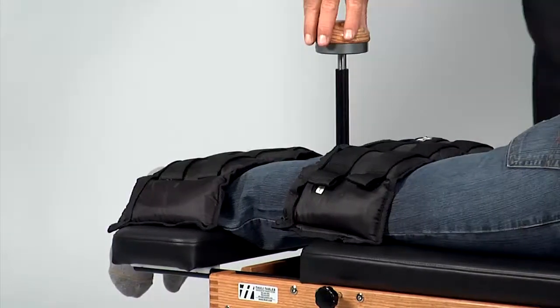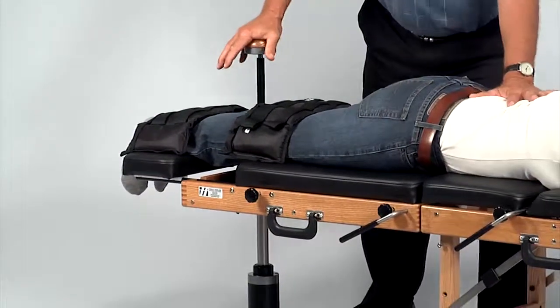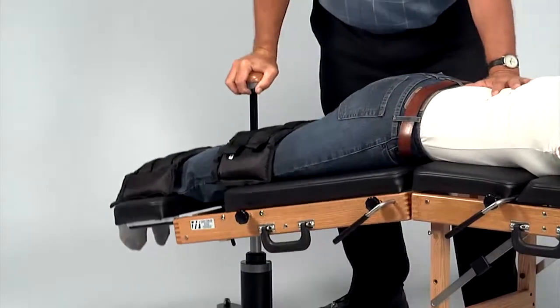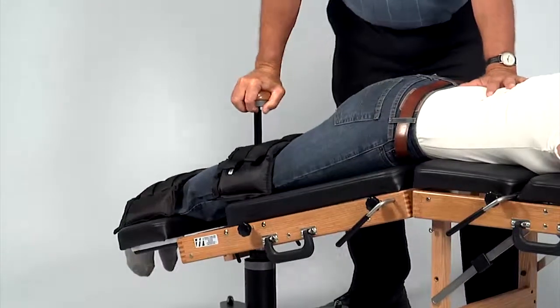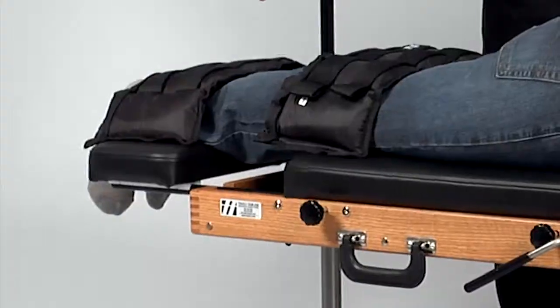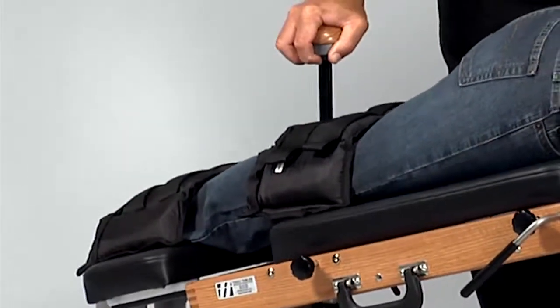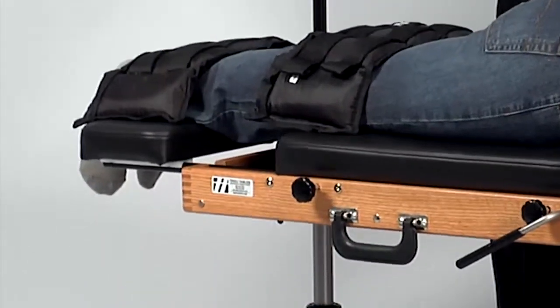Dr. Thule has determined that one weight draped across the ankles and one draped across the back of the knees is the best combination for his preferences and his patient size. The weights not only act as a counterbalance but also help to hold the patient's legs in place, aiding in the distraction portion of flexion distraction.